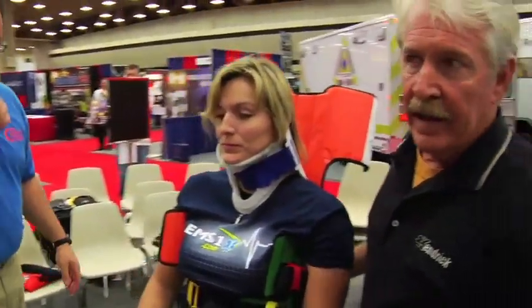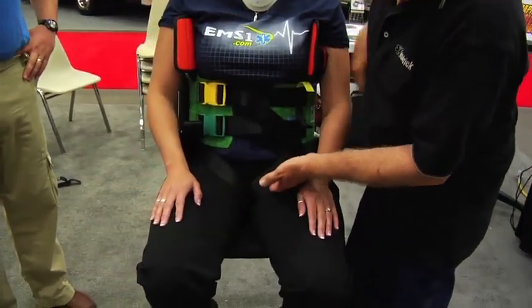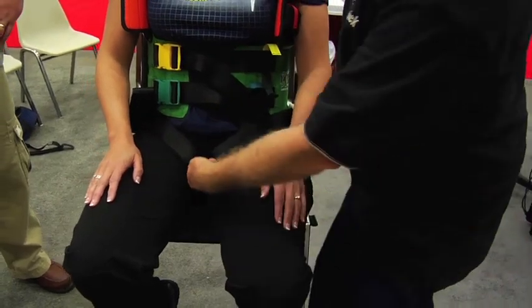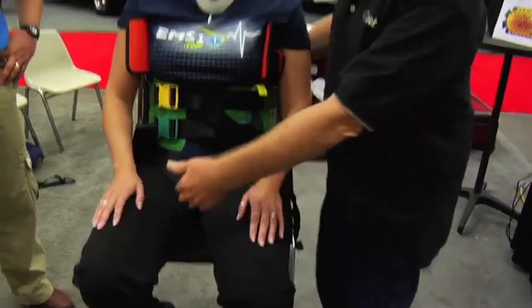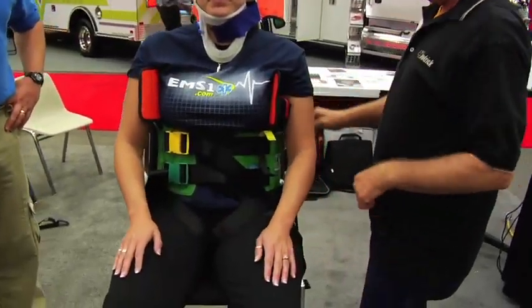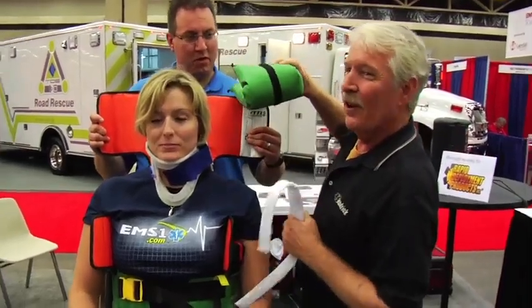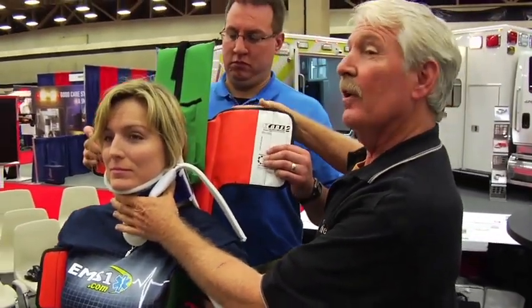A question that comes up quite often is whether you go back to the same side or crisscross in the groin. If you came right up the middle, it really doesn't matter — they're both in the same spot. It doesn't matter whether you go back to the same side or crisscross in the middle. Because I mildly erred and forgot to put our patient all the way back, we're going to have to pad behind her head because we're not going to be able to push her all the way back.